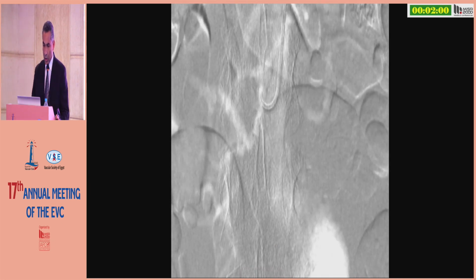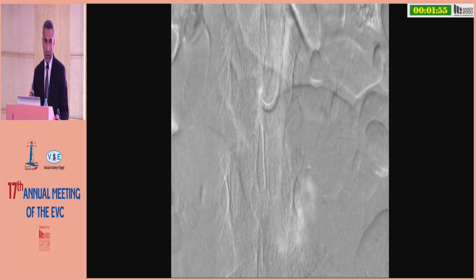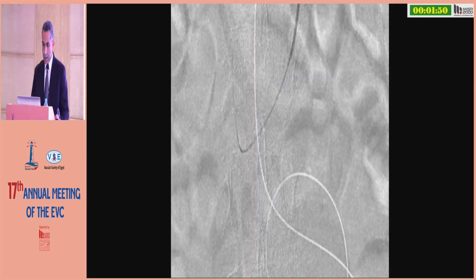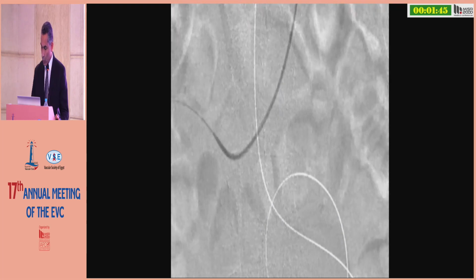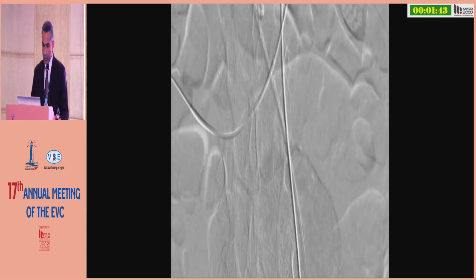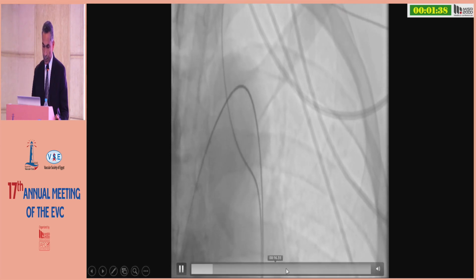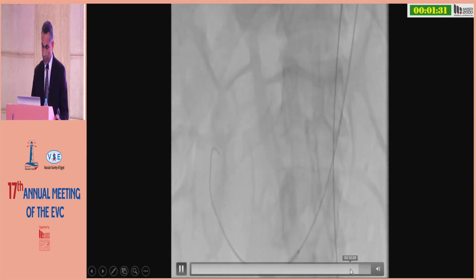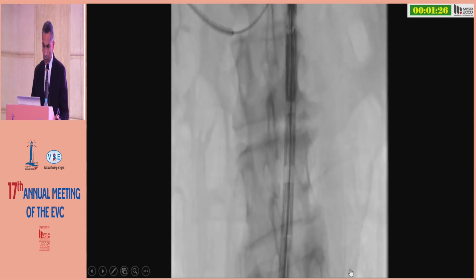We started cannulation from the left brachial artery because he has a short neck, so we need to cover the right renal artery with a chimney. And then we started routine EVAR with chimney, or CHEVAR. The main body is now introduced.